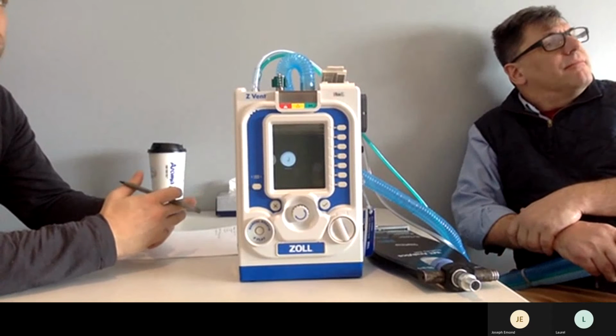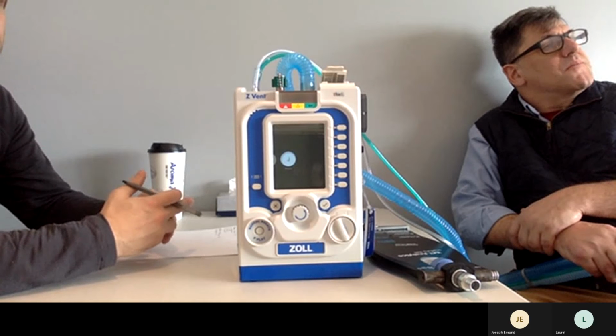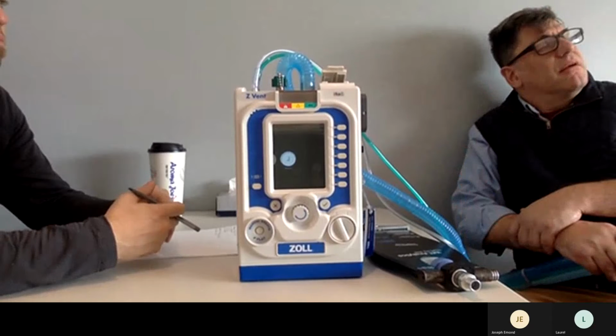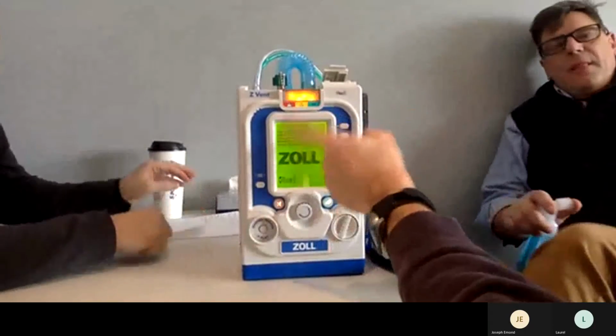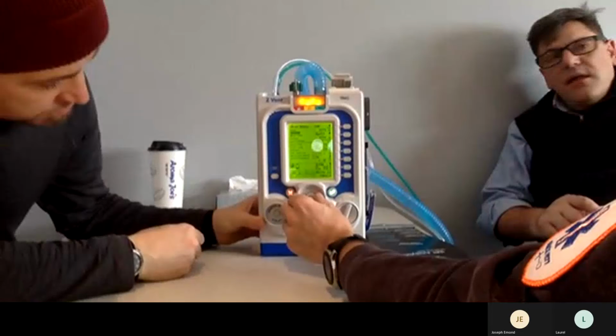So BiPAP mask on, see the new mask. If I remember correctly from the last class we did, when they came down for the demos, there was a leak control. Yes, we talked about that. Ready to do it again? Fire it up. So when you go to CPAP, one of us scoop this back. You come down to CPAP.